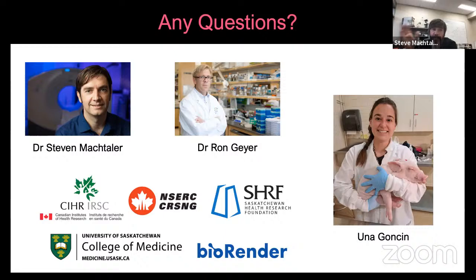to get them out of the vasculature and into the actual tumor. But the problem there is you can't do molecular imaging like that because there'd be no way to wash it away. But you could theoretically load the drug and then cause them to release their payload. The microbubbles that we use can't leave the vasculature, so you'd be looking at spatial delivery just in that particular region, but we can spatially restrict where we do the delivery because that's where we put the transducer. So you put it physically over a tumor and then you just pop everything that flows through. That's kind of how the idea is working right now.